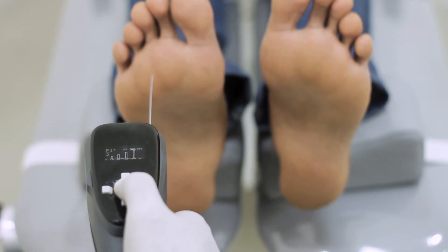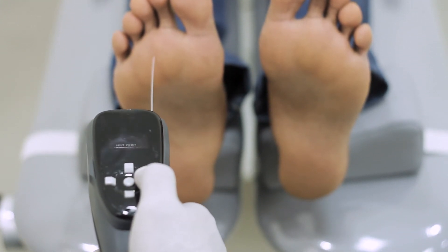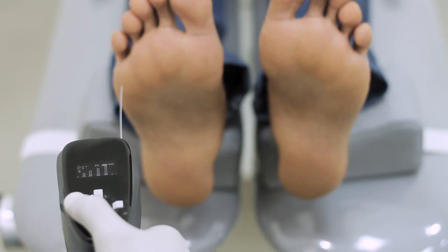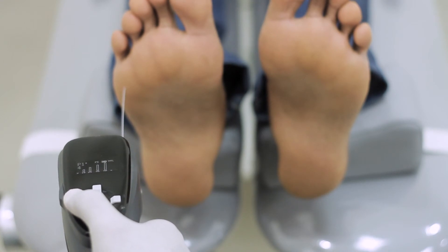When the subject responds with the confirmation of the touch sensation, retract the device.